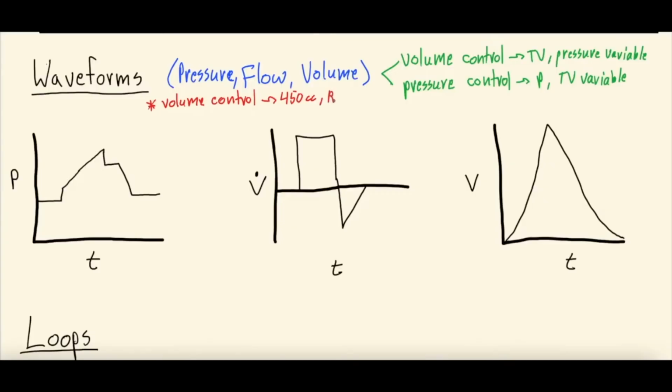You'll set their respiratory rate, say 16, and then you'll set their PEEP, their positive end expiratory pressure, and we'll say you set their PEEP at 5. The other thing you set is their FiO2, their fraction of inspired oxygen, and we'll just say 50% for this case. Not many of these numbers are relevant for this discussion, except for the PEEP, and then just knowing that they're on volume control, and we'll get into why.